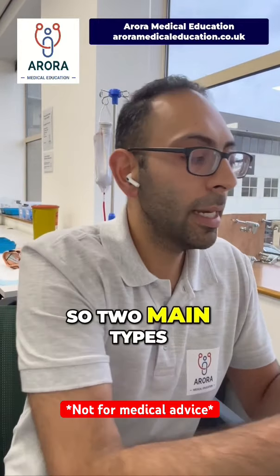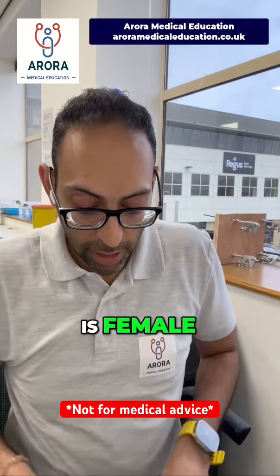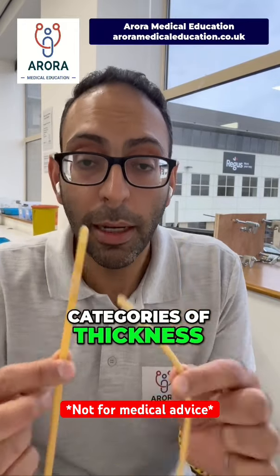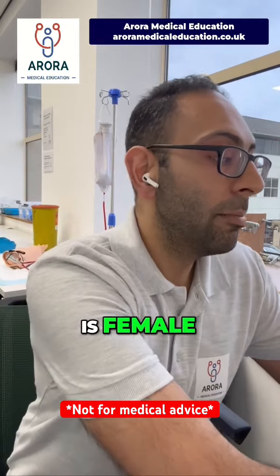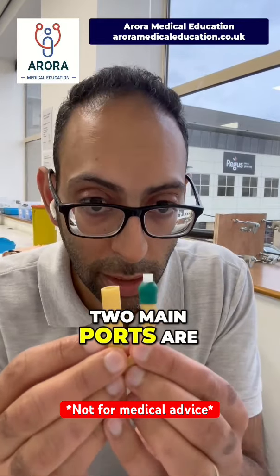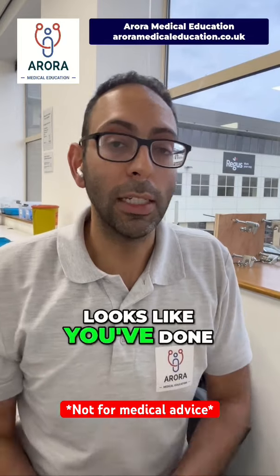Okay, so two main types of catheter. Longer one is male, shorter one is female. You'll see different thicknesses as well. I'm not too worried about you remembering all the different types of catheter thickness, but just remember longer is male and shorter is female. Make sure you look at the packet that should tell you it's female only, and make sure you're aware of what the two main ports are. So in the exam, in a case, you're right on top of it, and it looks like you've done it 1,000 times.